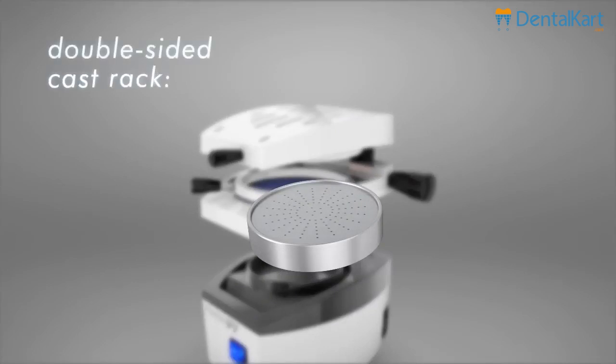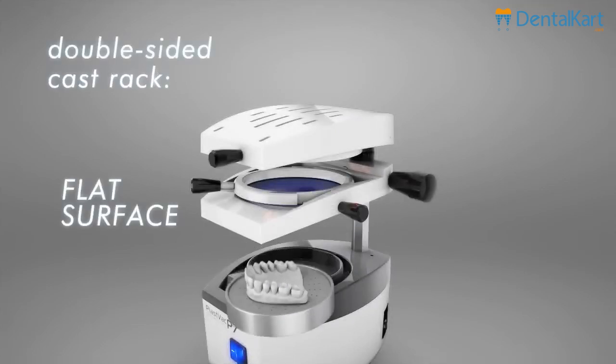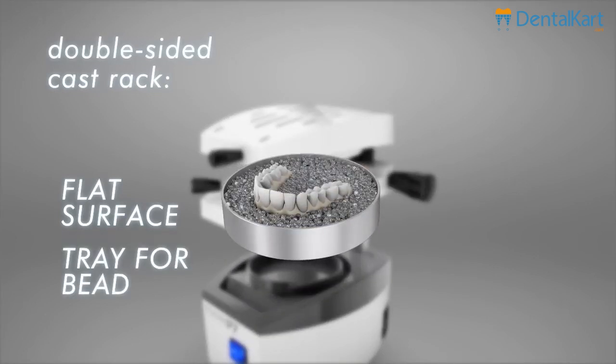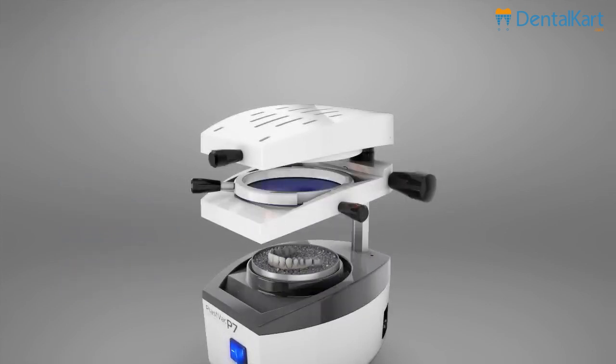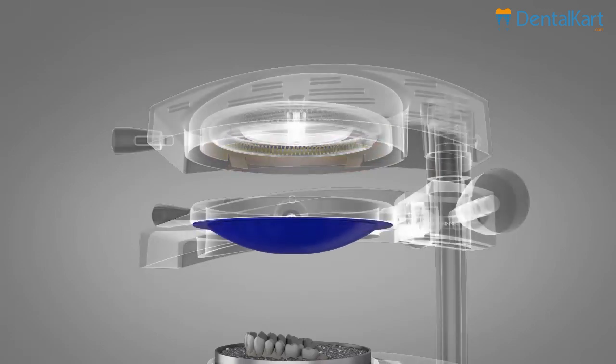It has a double-sided cast rack. The flat surface is indicated for soft sheets and casts with a good finishing. The tray for beads is indicated for hard sheets and non-finishing casts. This avoids sheet distortion, increases the airflow, and facilitates the cast removal, avoiding cast breaking.